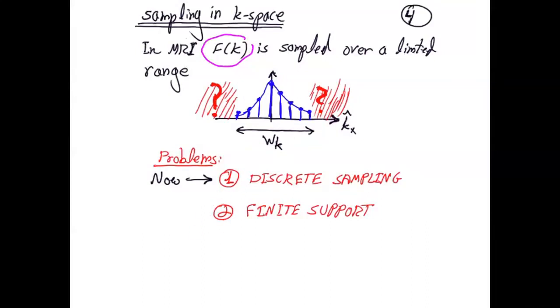Problem one is how finely I need to actually sample the area that I'm going to collect. So there are two issues. One is how fine, that's problem one. And the other one is that I don't collect the high frequencies. These issues would result in certain image artifacts, and that's what I want to cover here. We're going to derive quickly what the result will be. It requires you to think a little bit differently for those who are familiar with just sampling, just slightly different.